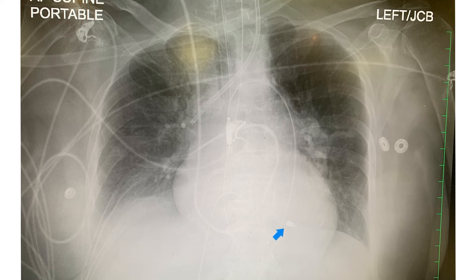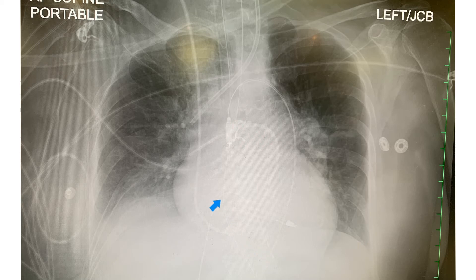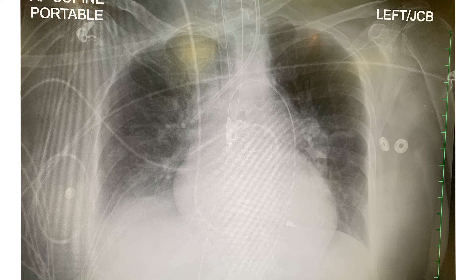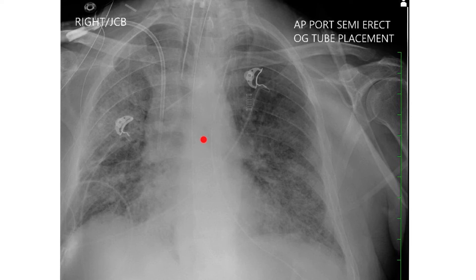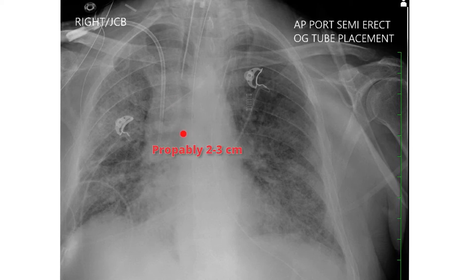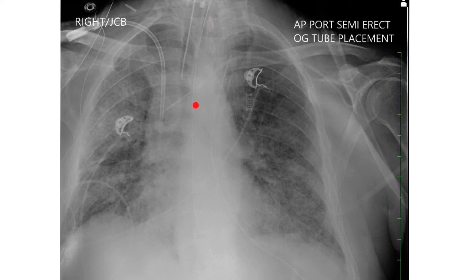Tracking the fine line all the way below the diaphragm — that's the NG tube. There's an opacity here that looks more like atelectasis with vascular congestion and increased interstitial markings on both lungs. Finding the carina: the left main stem and right main stem are visible, placing the carina here. The ET tube tip is here — roughly two centimeters. There's also a large-bore dialysis catheter and diffuse bilateral infiltrate.